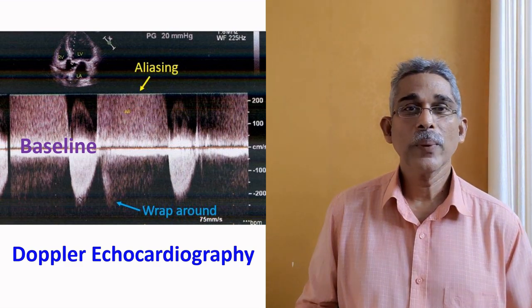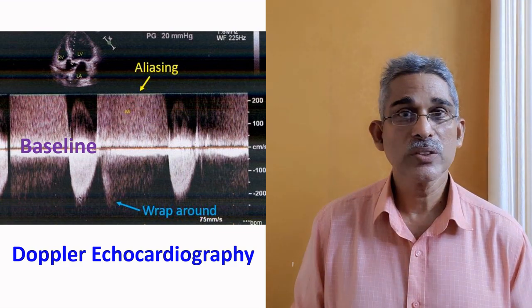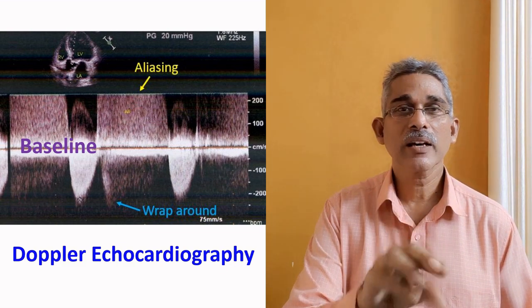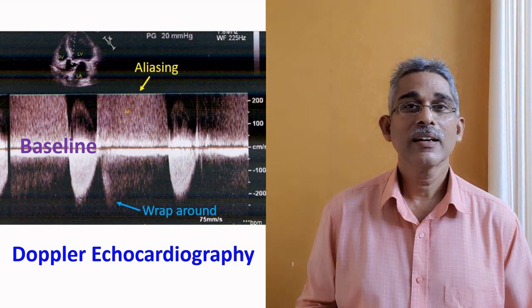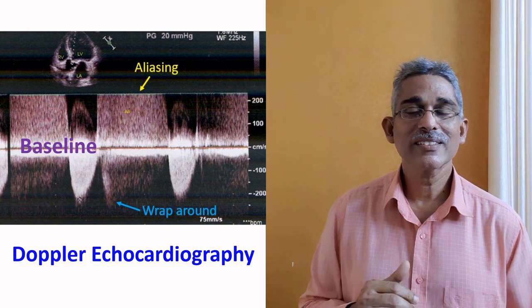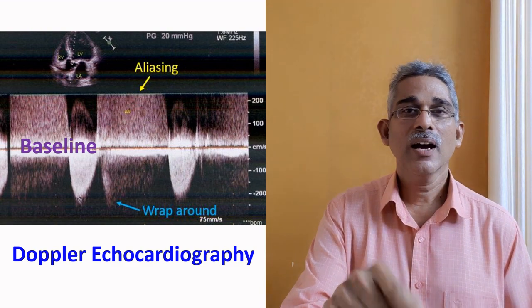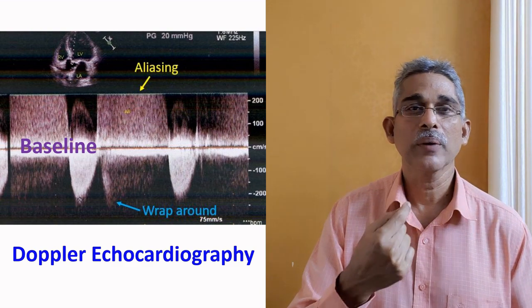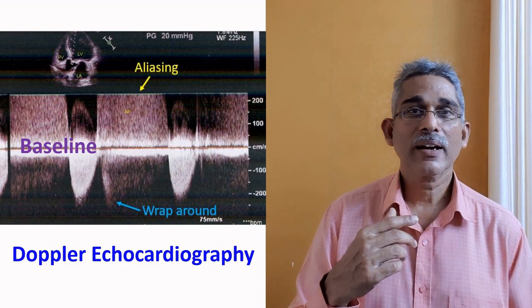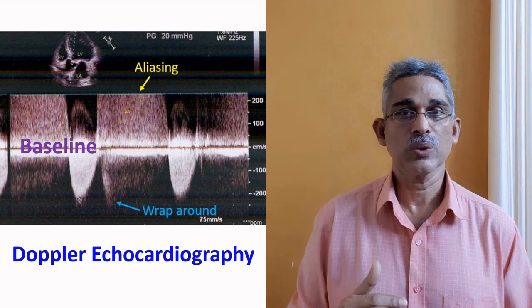And when the Doppler shift, or change in frequency, can be detected, you can find out the velocity of the train. Similarly, the ultrasound beam is focused on the red blood cells in the heart and the blood vessels, so that when the reflected signals are received, the change in frequency, suppose you are sending out 2 megahertz and there is a slight change in the received frequency, whether it is increasing or decreasing, you know whether the blood cells are moving towards the transducer or away from the transducer.